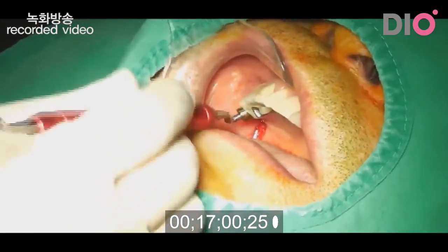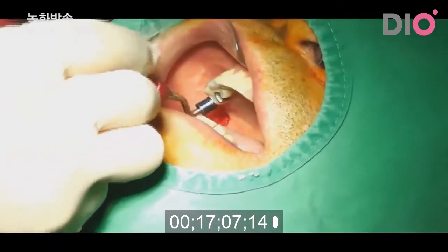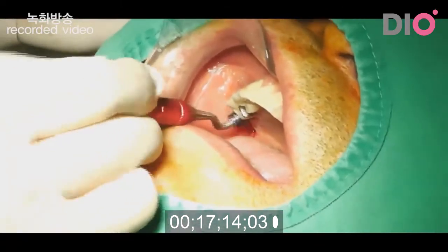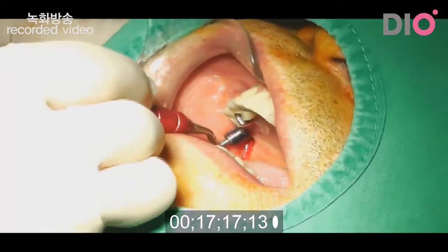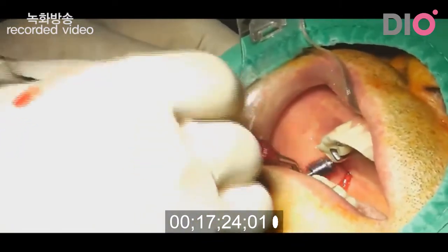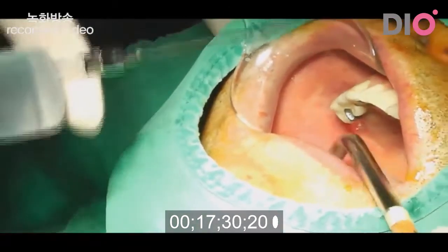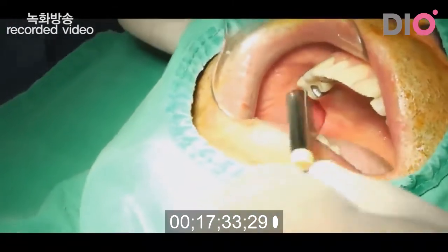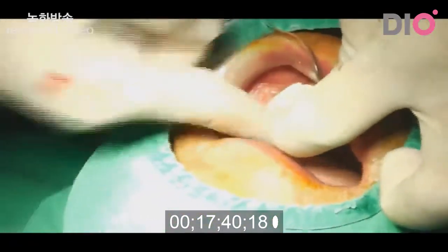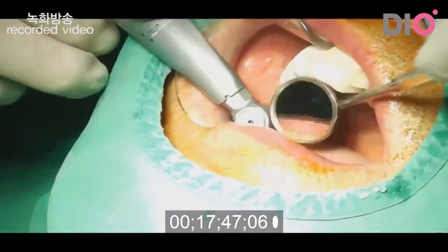This 0.5 milliliter of collagen sponge was inserted in both sides, and then I spread the material in the sinus cavity in the second molar area again. Okay, and then suction. Then I place this surgical guide in the mouth again. This is the last drill I used, the final drill. I drill the final drill again.